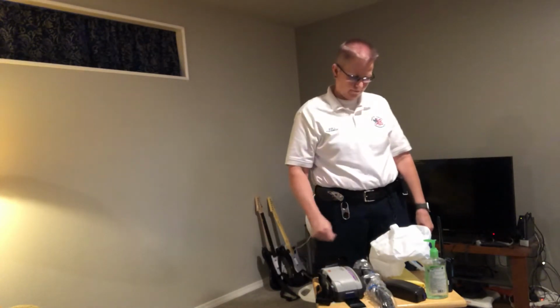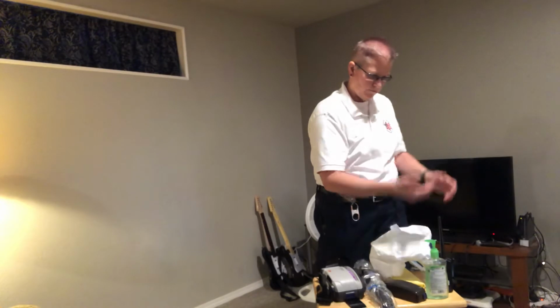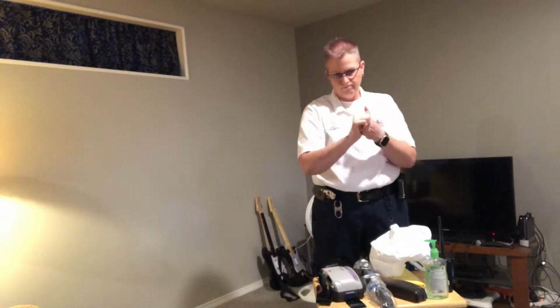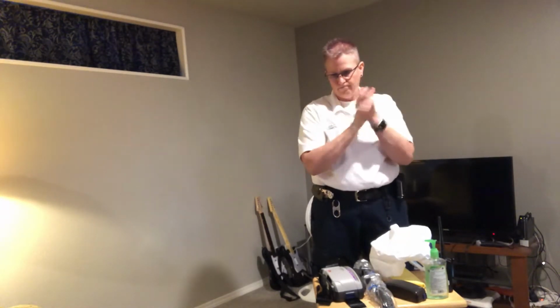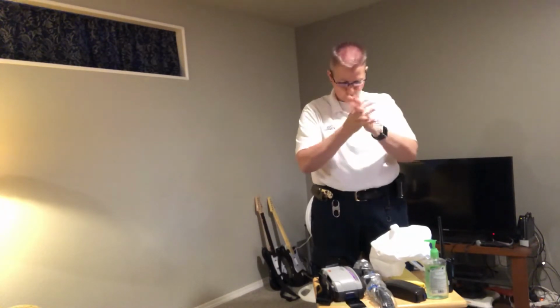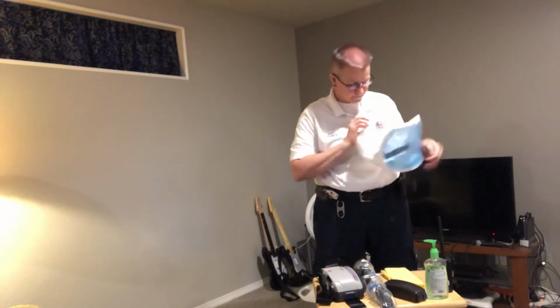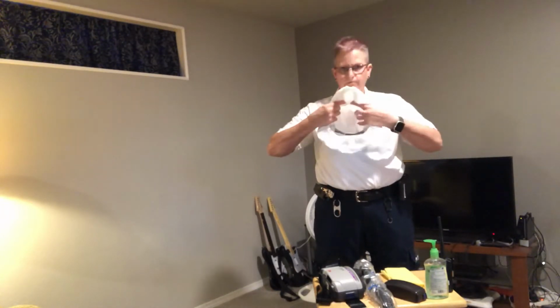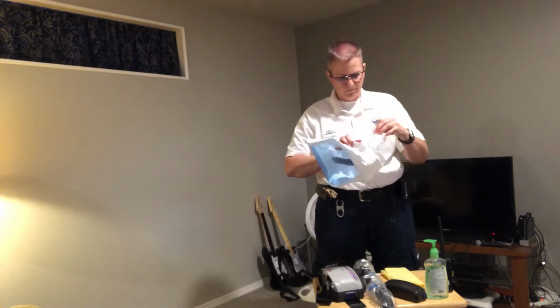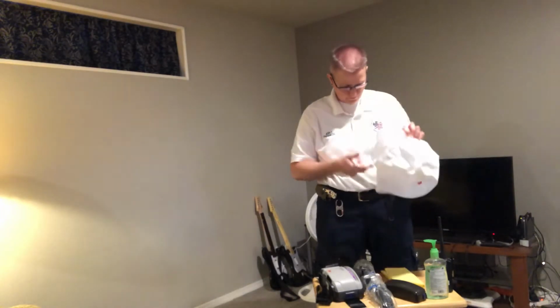So now that that's off, you're going to make sure you have the PAPR unit. Now, normally in a non-crisis scenario, when they have enough to go around and we're not worried about resources, when you first get your hood, you'll get sized to see what size you are. Really not that hard. There's a fitting mechanism on the inside of the hood that can adjust in size small, medium, and large, obviously. Jody can kind of show that. Yeah, there you go. You can expand it to your own personal melon shape and get it as snug as possible. Comfortable. It's not supposed to hurt you or cut off blood flow or anything, but you want it snug and tight.